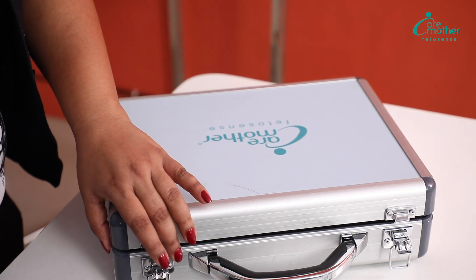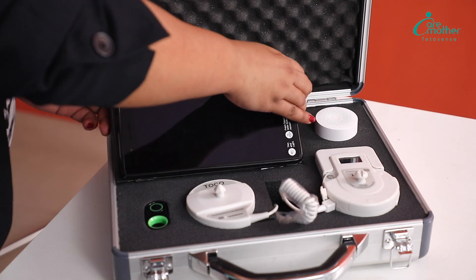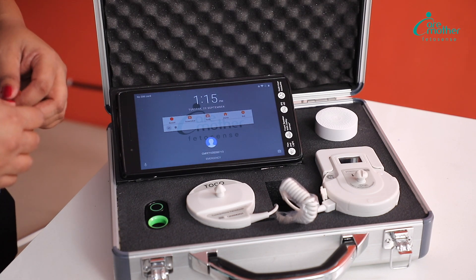Let me take you through the components of the Fetosense Kit. This is the tab. This will act as the display screen for your test.